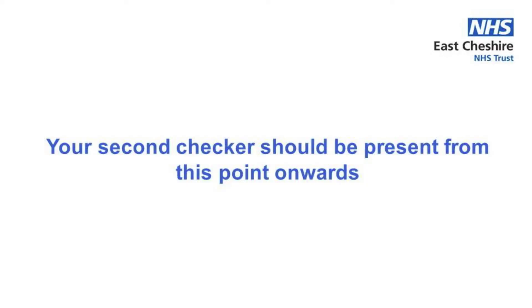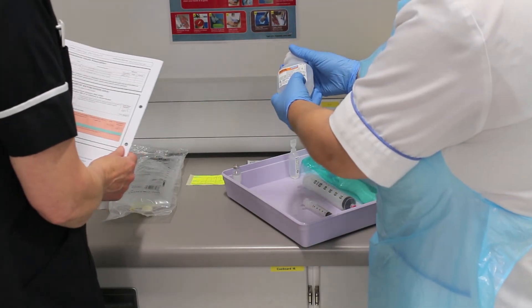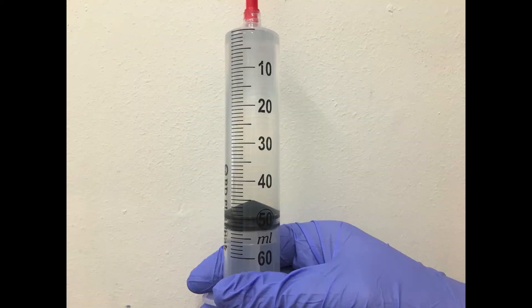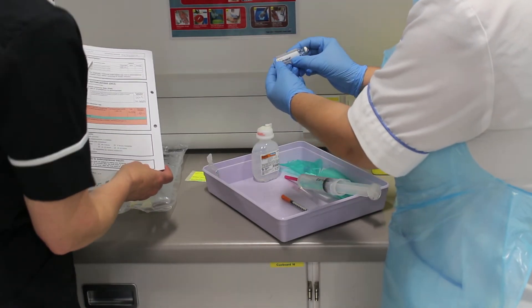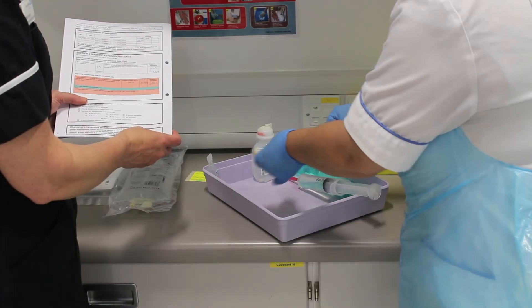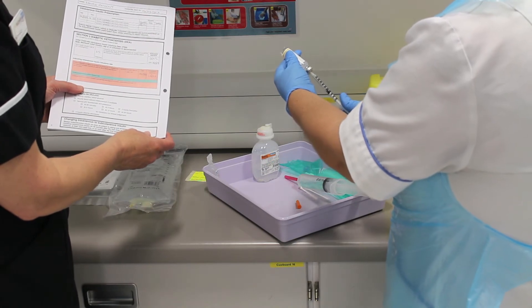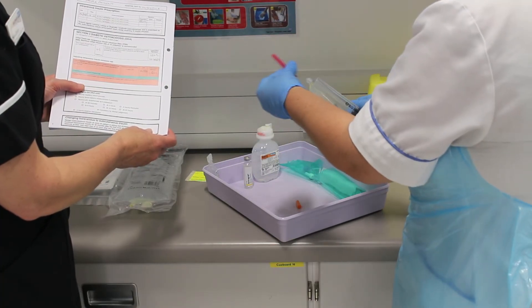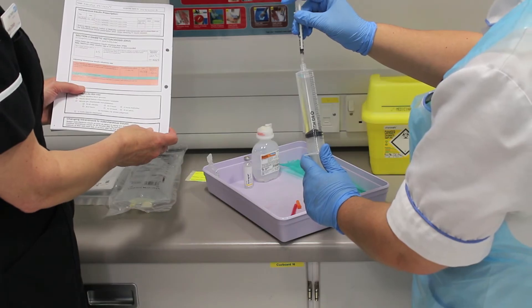You will now need your second checker to be present before you prepare any of your products. Check the details of the prescription with your checker, then begin to withdraw 49.5 mls of sodium chloride 0.9% into your 50 ml syringe. Next select your insulin vial, checking name and expiry dates with your checker. Visually inspect the vial and gently roll it before withdrawing 50 units using your insulin syringe. Remove the needle from your 50 ml syringe and add the 50 units of Actrapid into the sodium chloride, then invert the syringe several times to ensure the insulin is dispersed.